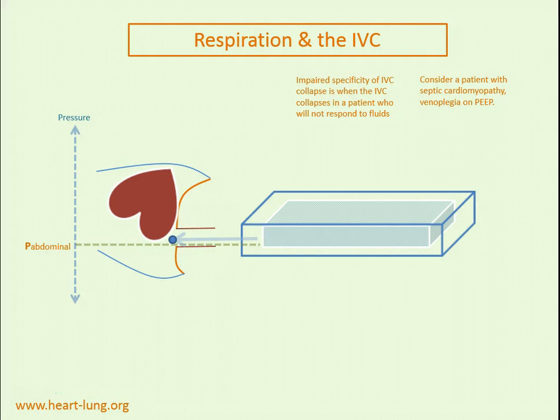Now here's the kicker. As I said, the patient is also on PEEP for whatever reason.